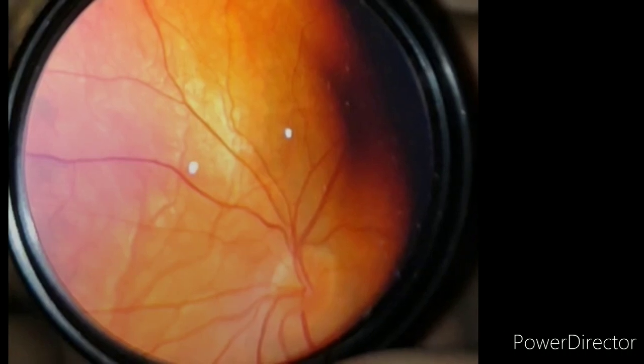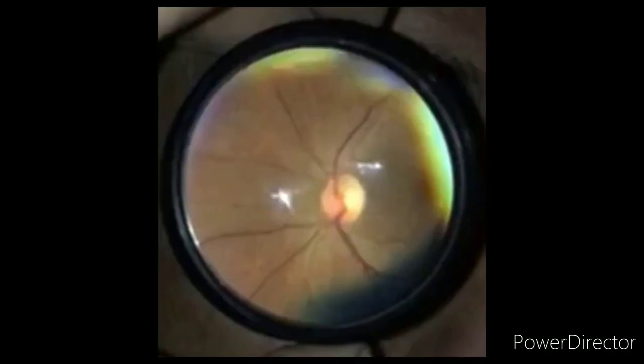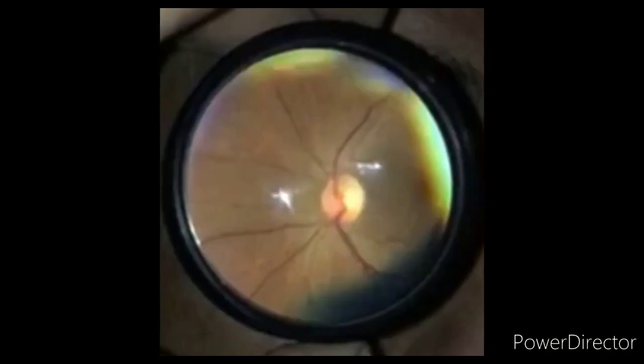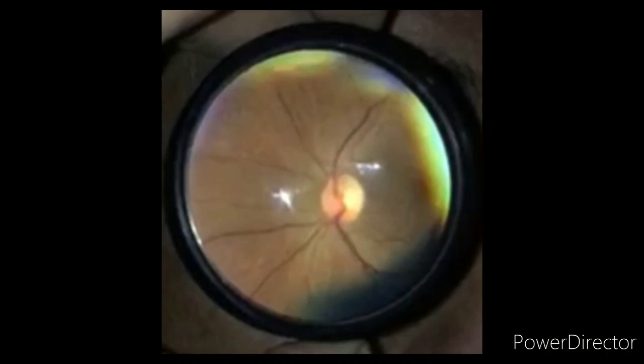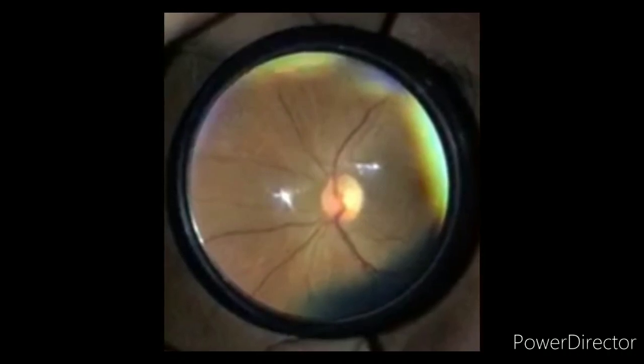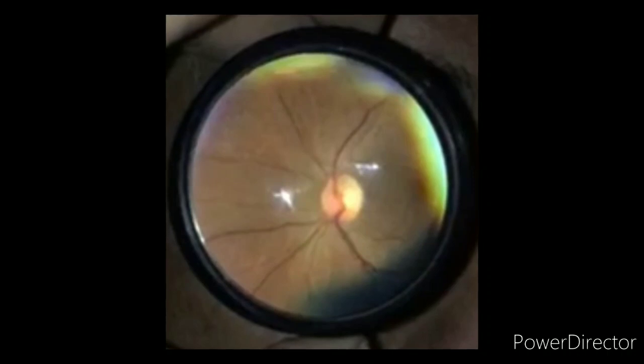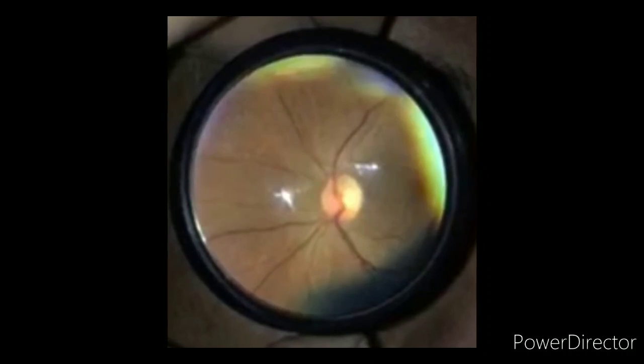Now in the second patient, you can see three of the ten area of the disc that is cupped. So it is a normal cup-disc ratio which is 0.3 cup-disc.